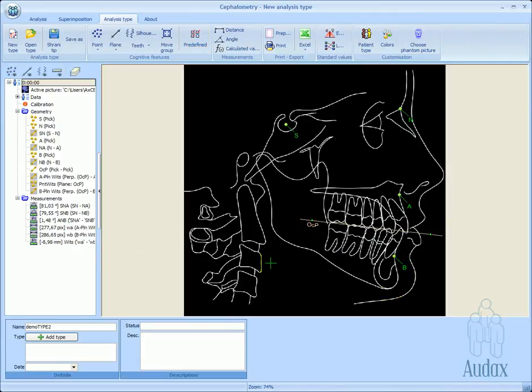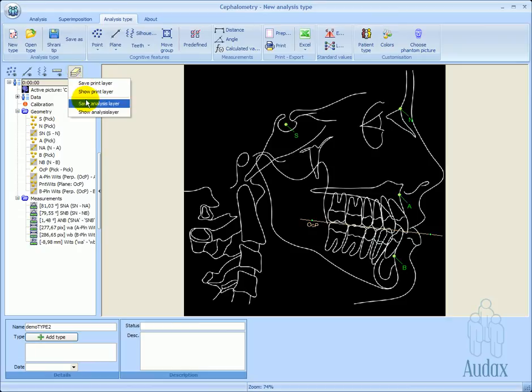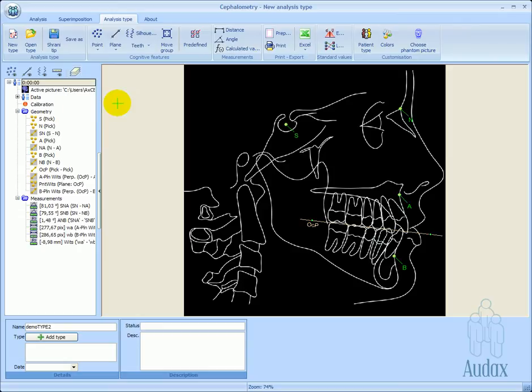A number of new elements appear in the structure tree. Some of these are visible and some are not. If the elements shown on the image are sufficient for creating the analysis, the view can be saved to the analysis layer.